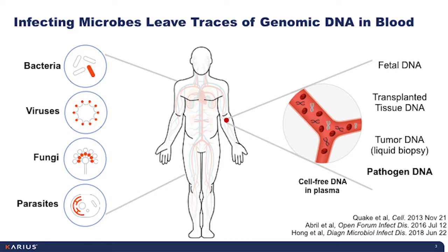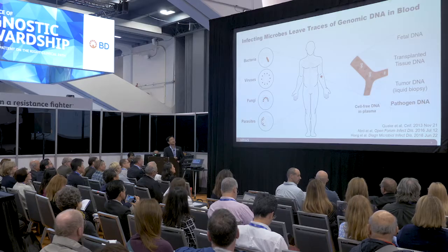This approach has been used in other applications, like looking at fetal DNA in pregnant individuals to diagnose trisomies and other fetal aneuploidies, all the way through transplant monitoring and tumor DNA or circulating tumor DNA. This is what the oncologists have called liquid biopsy, where you can take a plasma sample and non-invasively detect solid tumors without having to do a biopsy. We think of our technology as a cousin of that technology. In fact, as a liquid biopsy for infectious disease, being able to identify both bloodstream infections and deep-seated infections with a single non-invasive test.